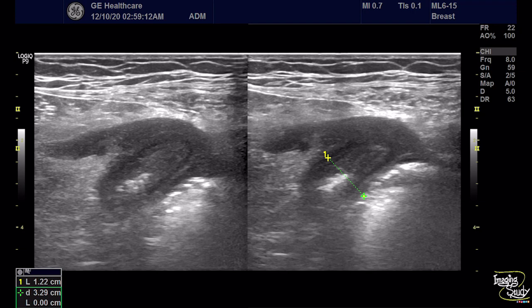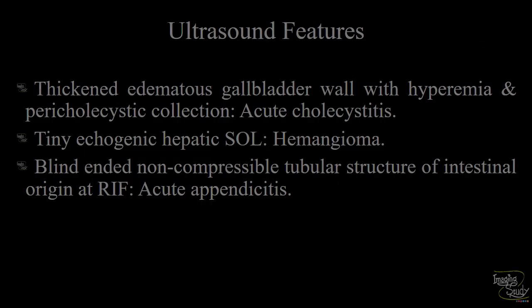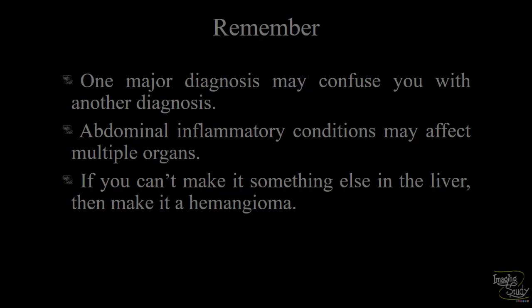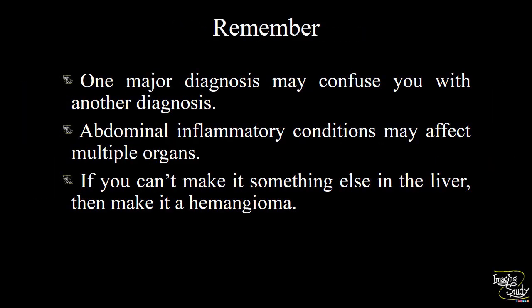The diameter of the appendix was around 12 millimeters and the gut signature was present. In summary: there is thickened edematous gallbladder wall with hyperemia and pericholecystic collection indicating acute cholecystitis; a tiny echogenic hepatic space-occupying lesion that is possibly hemangioma; and a blind-ended non-compressible tubular structure of intestinal origin at the right iliac fossa, indicating acute appendicitis.